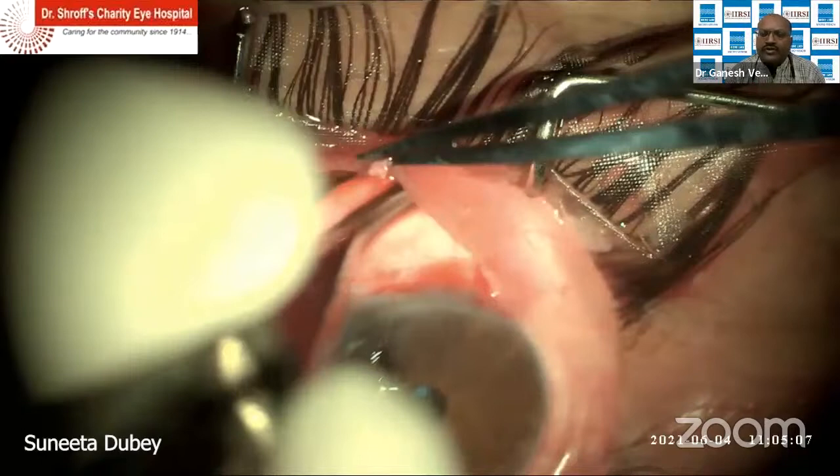And when I use Ologen, I use all releasable sutures. The last releasable suture is usually very difficult to pluck out, so it functions as a fixed suture. But the first, second suture you can easily remove, and you can titrate your pressures very nicely.